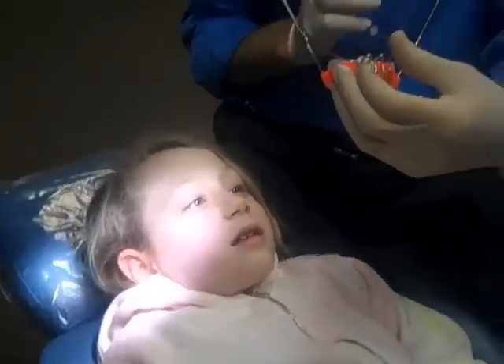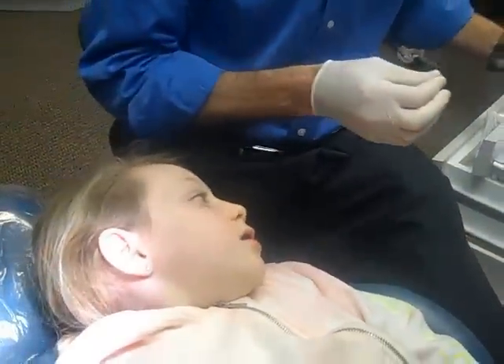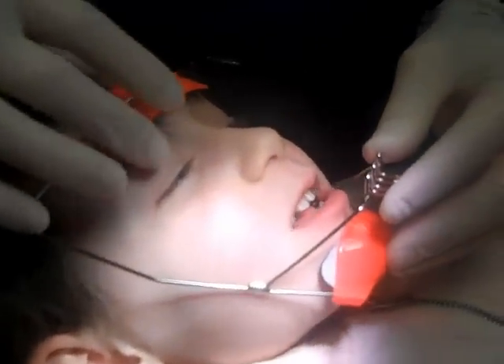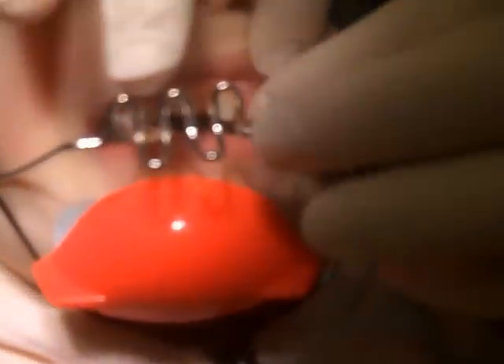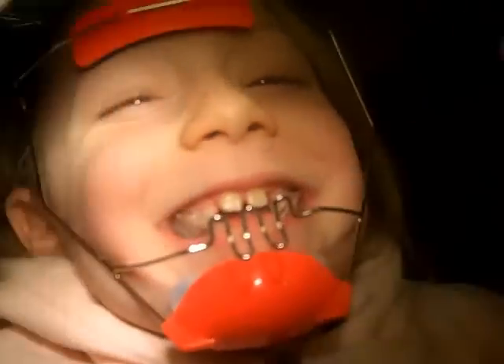We are back with Logan. We're now going to show you — this is the other part of the expander, this is the face mask. I'm going to show you how easy it is to put on. It attaches — there's a little hook in the mouth, a little metal hook, and we put our rubber band on here just like that. Then we go to the other side, find our hook, and put it on just like that. We then bring the mask to the face, grab our rubber band, and put our hook to the mask. Simple. And it's on — that is it.